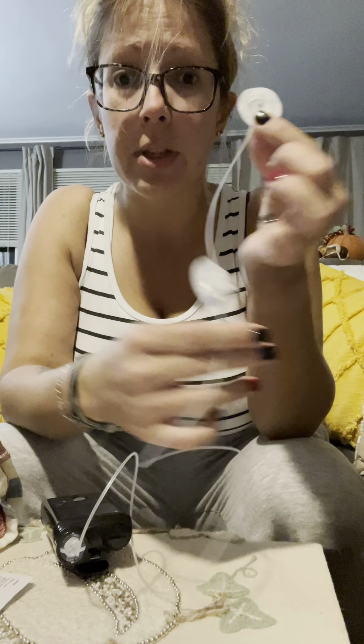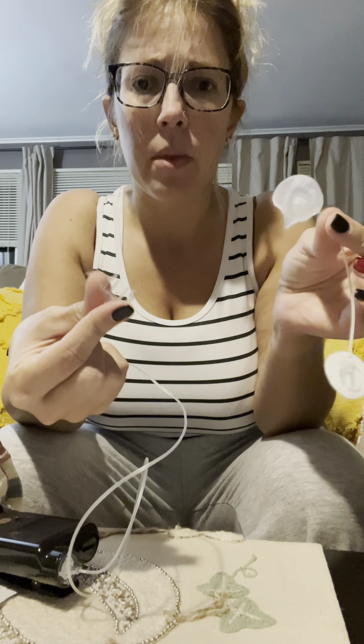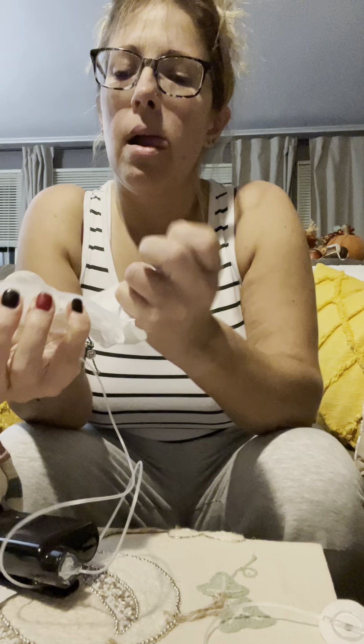When you go to do your second one, you can use the same tubing if you're not changing your reservoir. I change my reservoir like once every 10 days, so I use the same tubing for 10 days and I've never had a problem. So what I do is disconnect this piece here, and to do yours, you would connect this piece. I would connect it if I were starting fresh — I'm not starting fresh, so I connect this.